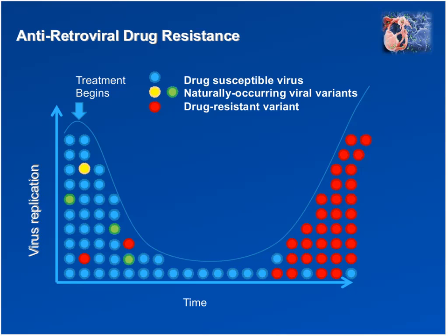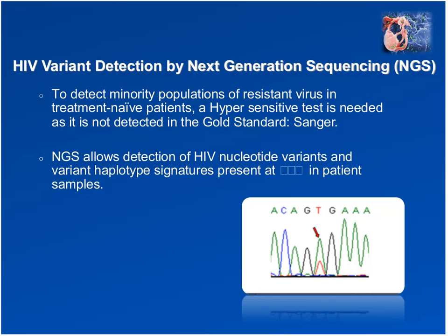As you can imagine, HIV genotyping, or testing for the presence of drug-resistant virus before treatment begins, is now an important part of clinical care. As it turns out, deep sequencing of HIV using next-generation sequencing approaches provides an ideal solution to this need for sensitive HIV genotyping. Through next-generation sequencing, HIV drug-resistant variants, as in the viruses with the mutations that allow the virus to evade the antiretroviral drugs, can be identified in patient samples at frequencies below 1%.